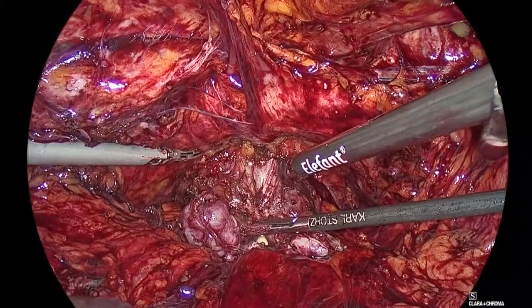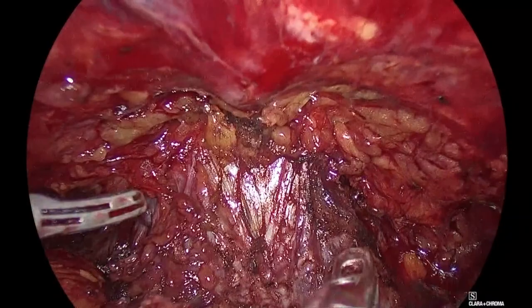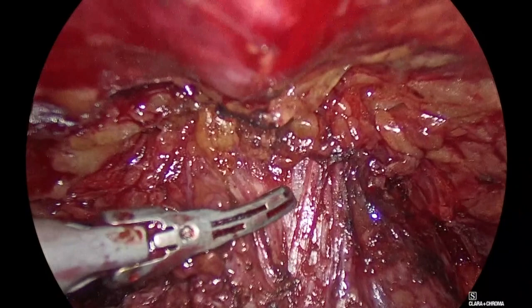So let's come in, orient ourselves. Yes. Look what we've done up to here. Look where the prostate is. Prostate is here. Pubo-prostatics are here. This side again. Prostate is here. Prostatics are here. Put the gas up a bit, please. Come in, close. Look, so I don't go here. A bit shorter. There, here. Good. Put the gas up, please.